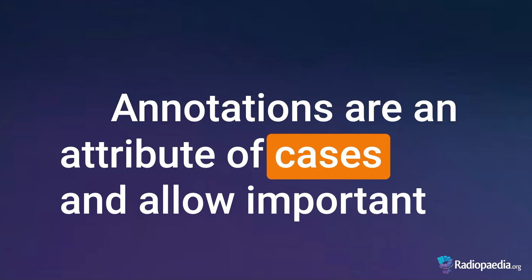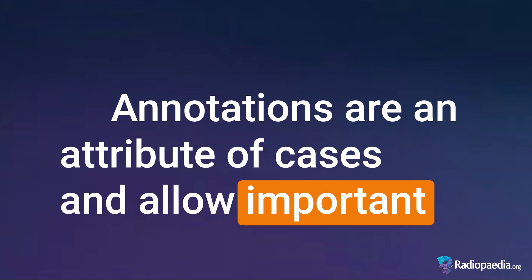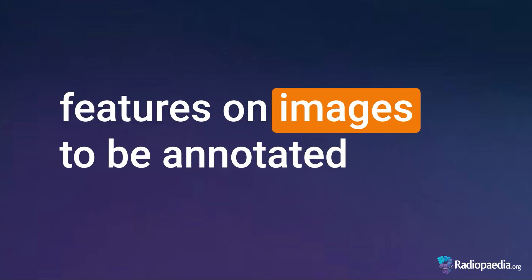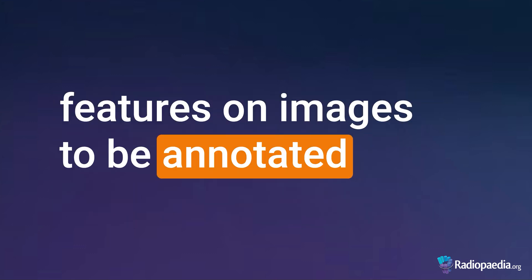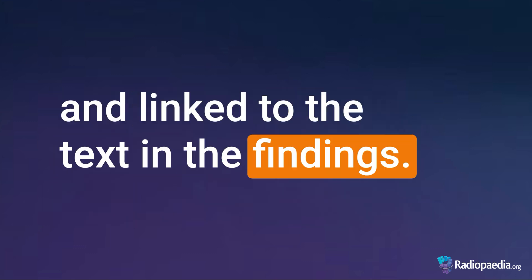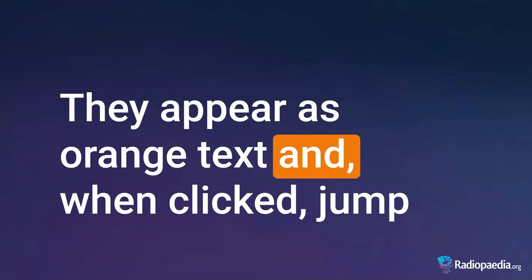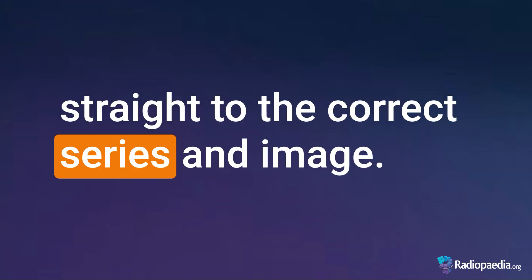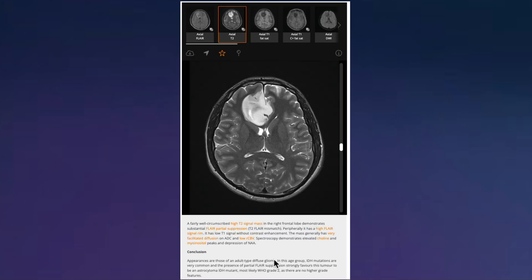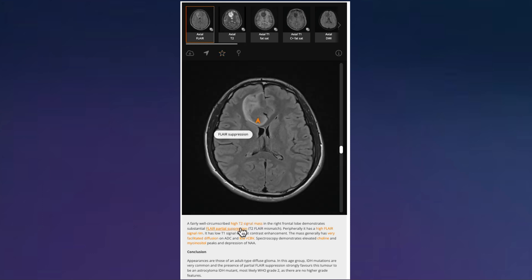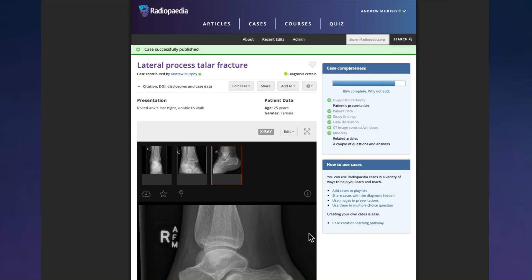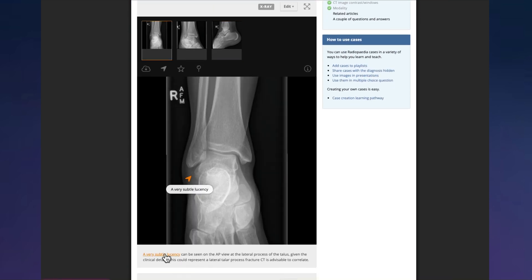Annotations are an attribute of cases and allow important features on images to be annotated and linked to the text in the findings. They appear as orange text and, when clicked, jump straight to the correct series and image. This feature transforms your cases into interactive, explainable studies that highlight important findings. It makes for great teaching cases.